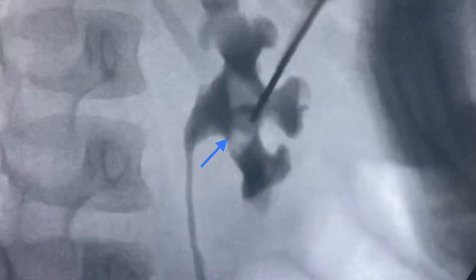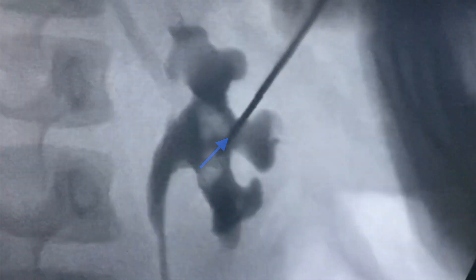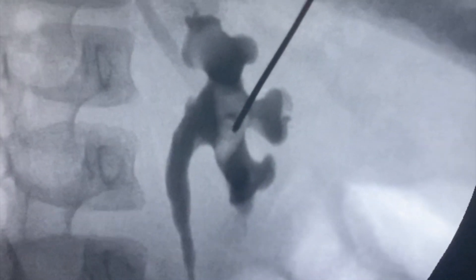This is a live image where you can see the same calyx I am targeting. Initially, I found that the 12th rib was coming in the way, so I changed my angle slightly above the 12th rib and directed the PCNL puncture needle to that calyx. The contrast in that calyx empties faster because it is a posterior calyx in a non-dependent position, so the contrast drains down. You have to inject contrast repeatedly to identify this calyx.